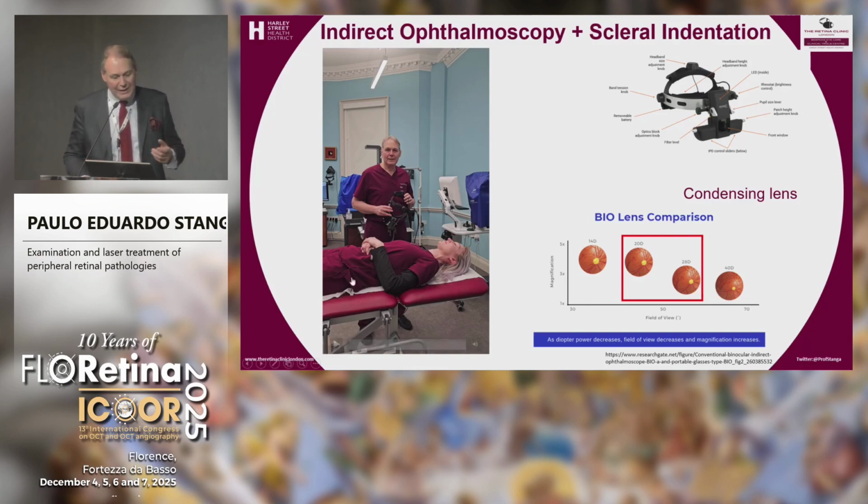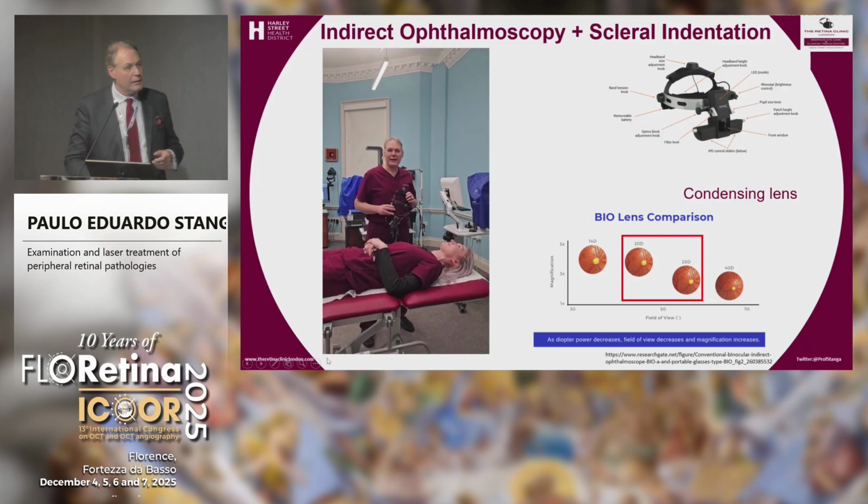Now let me show you the technique, one of the first videos on the technique of scleral indentation. It's important to explain to the patient in advance what you're going to do. Otherwise, the patient will go tense, the eyelids will go hard, and the patient will suffer and be uncomfortable. And this is what happens. Most of us don't realize that if you have a relaxed patient, this is very straightforward, and it should last 1 minute per eye, as I'll show you in a couple of minutes. Let me show you the technique.